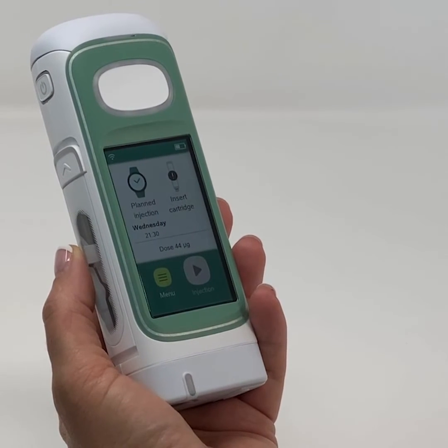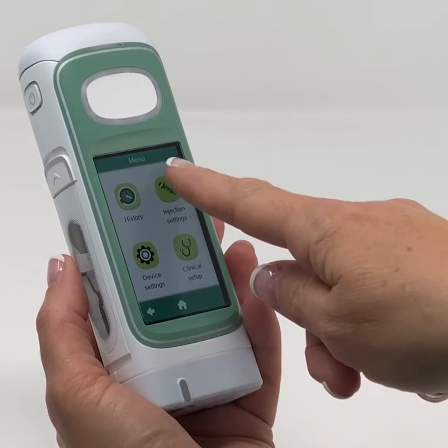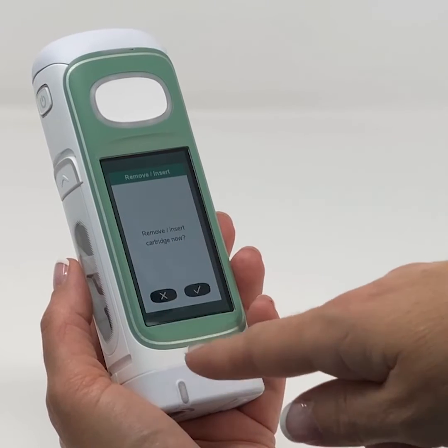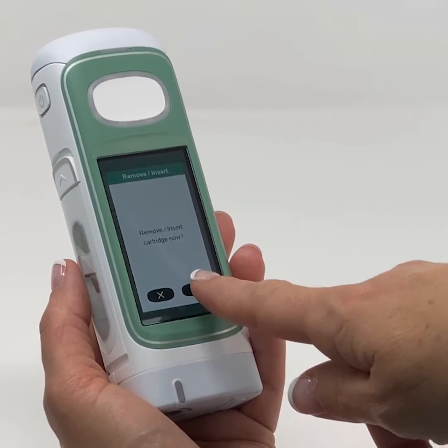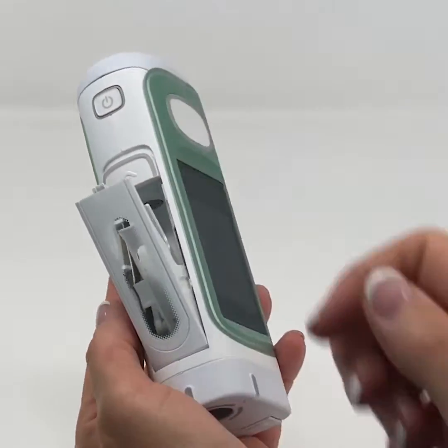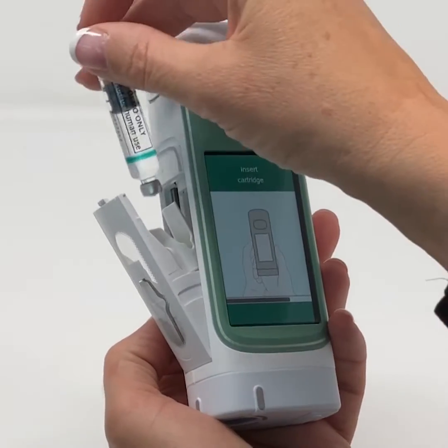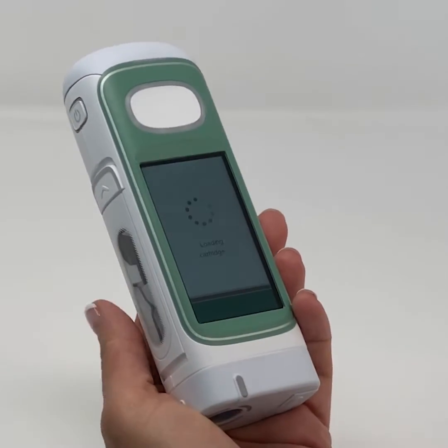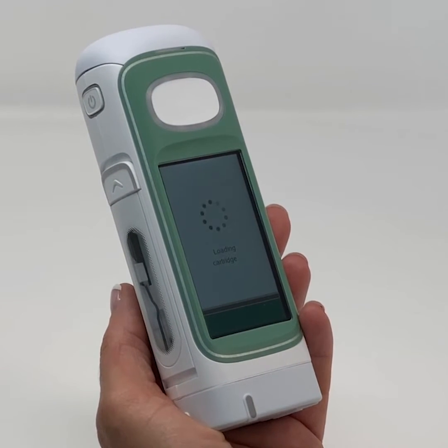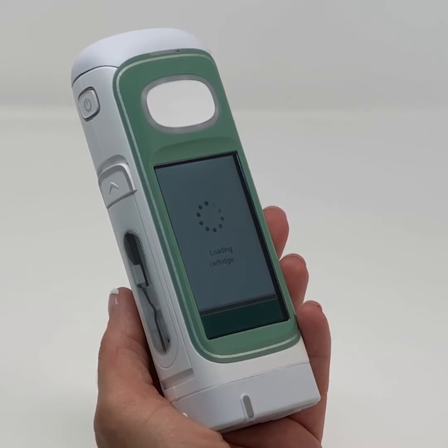To insert a new cartridge: go to the menu, select Injection Settings, select Remove/Replace Cartridge, check the mark, open the cartridge door, and insert the new cartridge. When a cartridge is in place and you're ready to proceed, simply press Start. Note that if you press Start without a cartridge installed, the information screen will tell you to insert a new one.